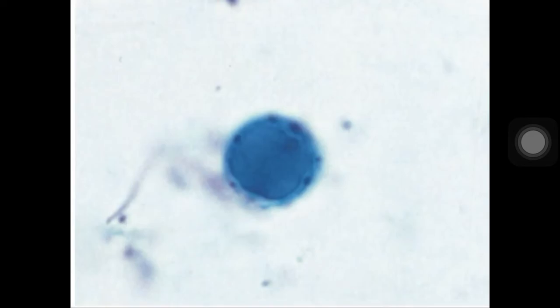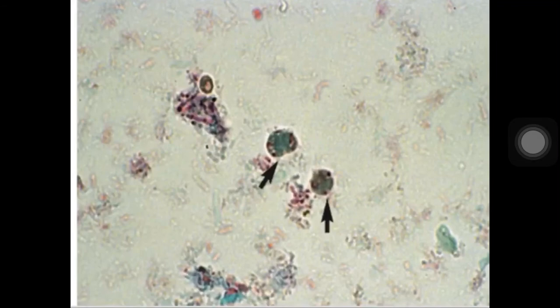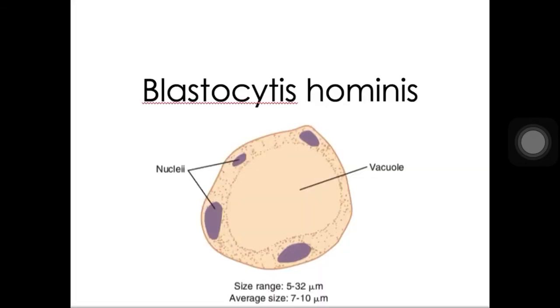Number 10. Okay, ito po yung image. Next. Okay, so this one is your, tama po kaya sagot natin. This one is Blastocystis hominis. So Blastocystis hominis po yun.